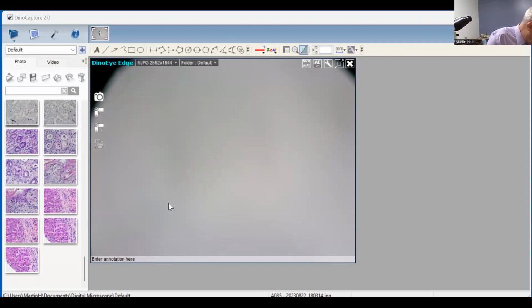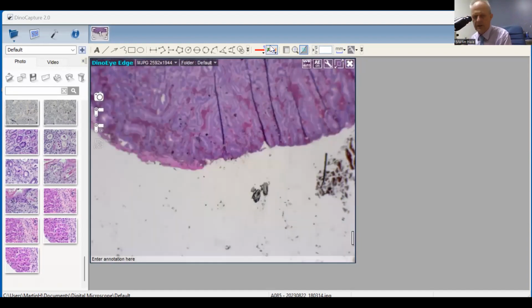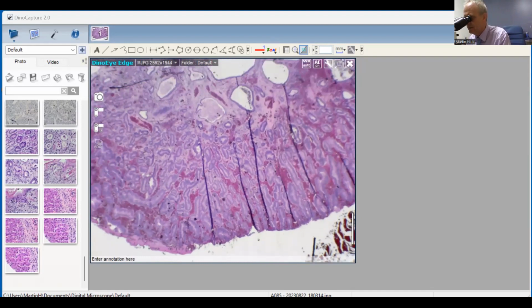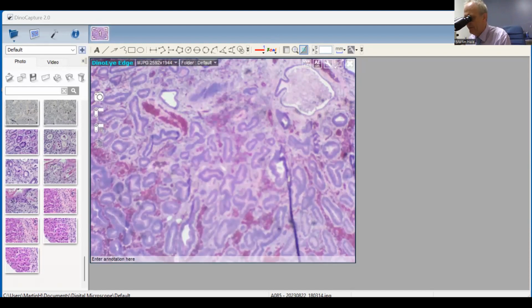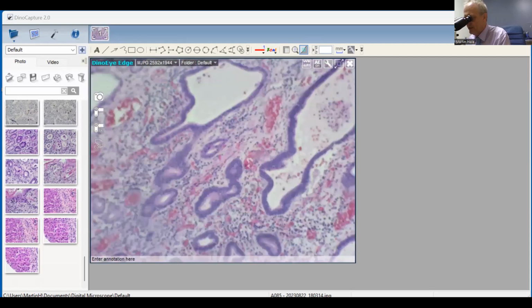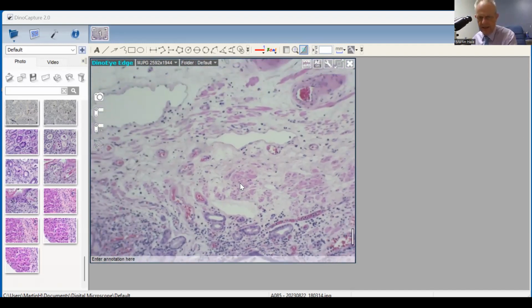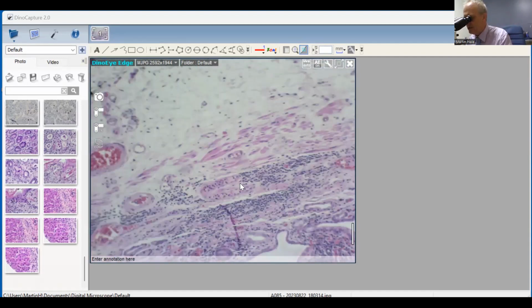And there was quite extensive tumor present in those nodules. And this is the tumor there. You can see, I can't go any lower, unfortunately, but that's the tumor, the infiltrating adenocarcinoma. And here, you can see the muscularis there, muscularis mucosae, which is there. And the tumor is certainly abutting on the muscularis.